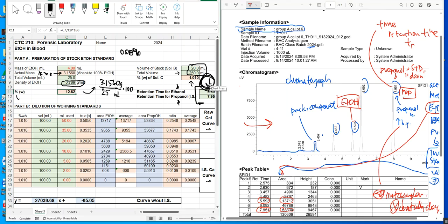So once more, those times can change from year to year. It might not be 5.5 when we ran them. It might not be 7.9 when we run them. Whatever the case is, those could be different, and that's okay. They're not meant to be the same every single time. We could go in and try to change some settings and try to make this a little bit better. So those values we will provide you in Part A of the spreadsheet template that you'll receive.